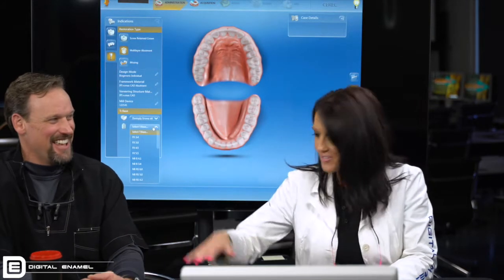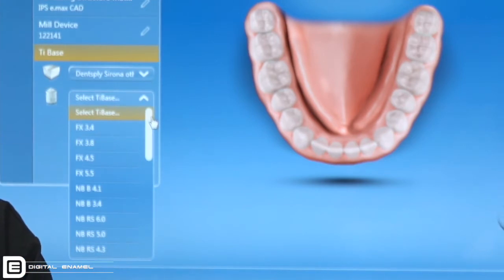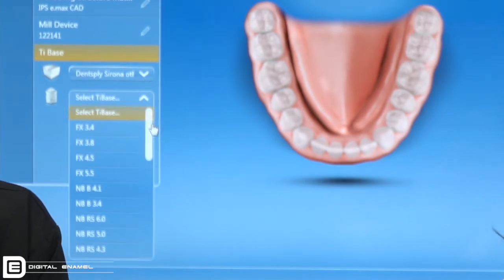If you have multiple milling units, you're going to select which one you're going to use. Next we're going to select Dentsply Sirona and then select your tie base. Here is where you have your whole list of tie bases — whatever your manufacturer is that you place or your oral surgeon places. A lot of times we use Nobel BioCare, so we're going to select Nobel BioCare Replace Select 5.0.